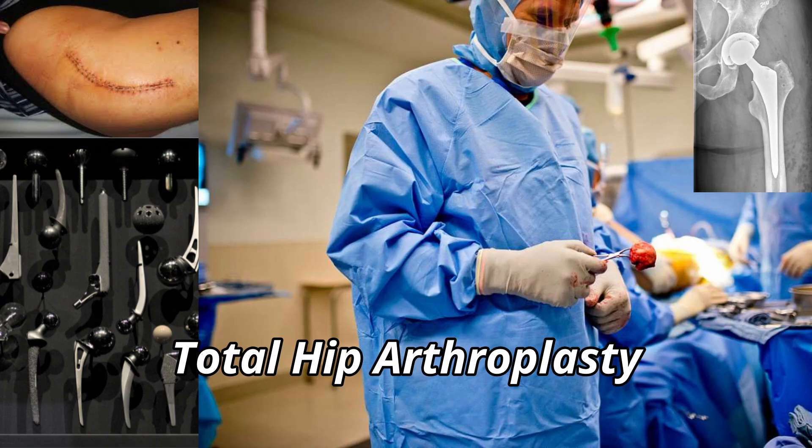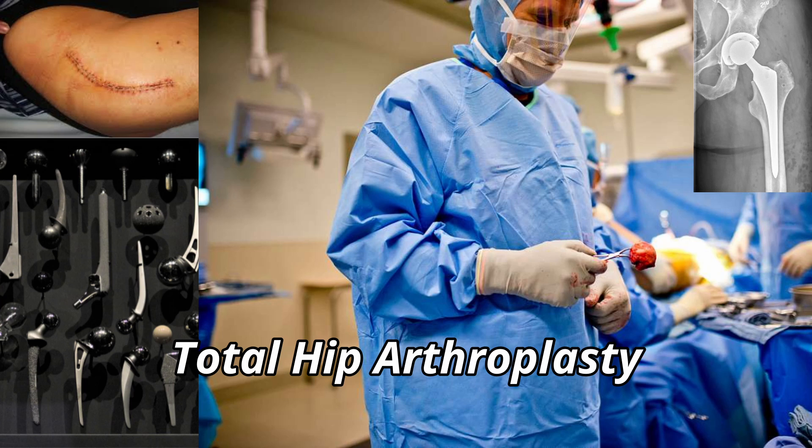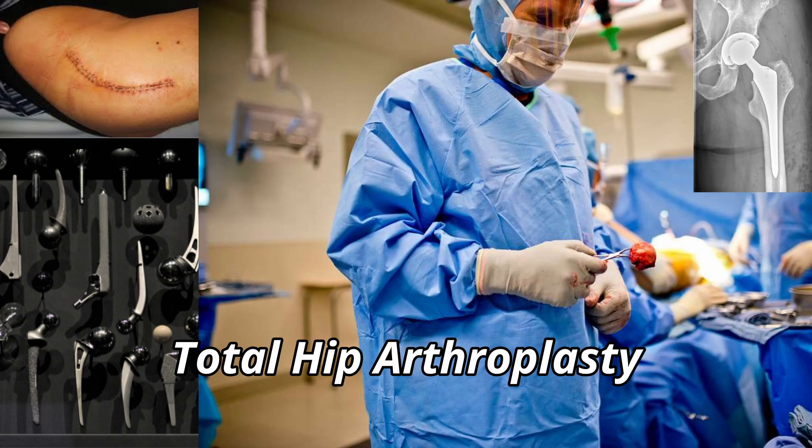Step 4: Acetabular Preparation and Cup Placement. The acetabulum is exposed with Homan or Cobra retractors. Residual labrum and cartilage are debrided with a curette and reamer. A series of acetabular reamers, increasing in size, are used to create a hemispheric cavity. Pearl: The optimal orientation for the cup is approximately 40 to 45 degrees of abduction and 15 to 20 degrees of anteversion. Malposition increases dislocation risk or wear. The acetabular cup is placed using an impactor and mallet, and fixation is achieved with press fit or screws.